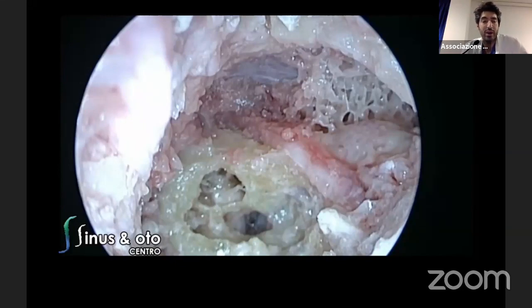Those teaching materials are the basic things by now. Can you imagine? I just want to raise a concern about this. Everything changed during the last 10 years, I guess, in the endoscopic era of the middle ear. We changed our field when we approach through the nose with the endoscope, and now we are facing differences by using the endoscope inside of the middle ear, and people are raising concern regarding, well, we are always used to do it with a microscope.